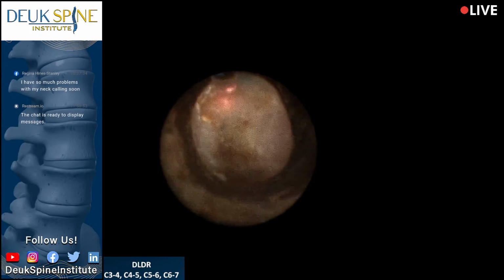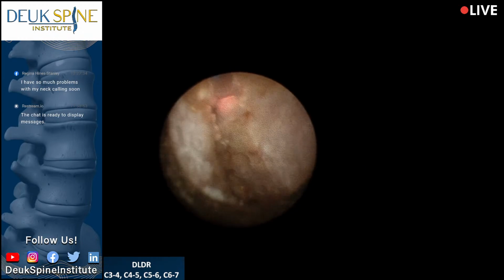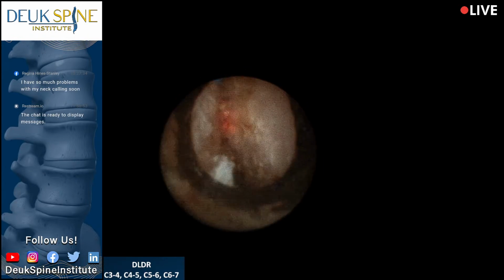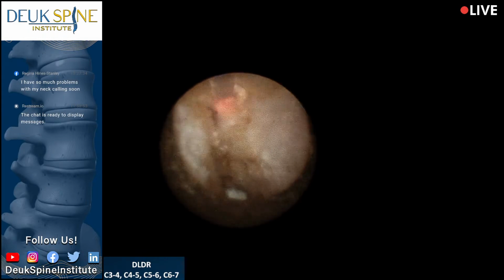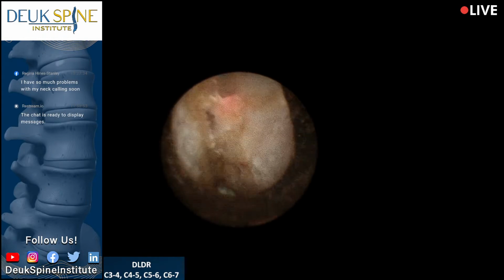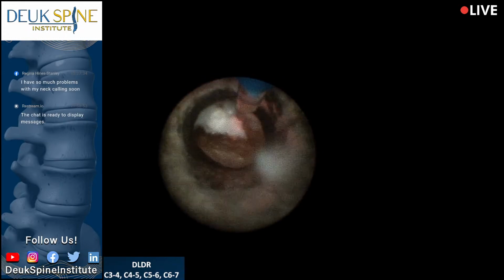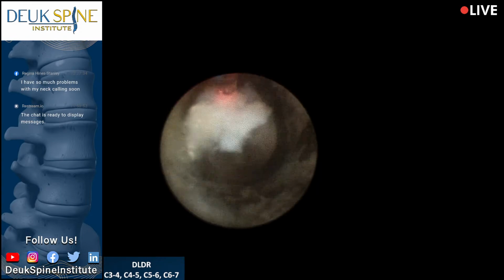And you can see I'm working beyond the limit of the tube. The tube I couldn't get back any further because the disc is so scarred together. The bones are so scarred together I couldn't get further back with the tube. But I'm getting further back using the scope. And I'm creating some movement here between the bones. So you can actually see some movement. Back to me. And what's moving are the vertebral bodies at the disc. So the disc is actually starting to move. When I first came in, there was no movement.